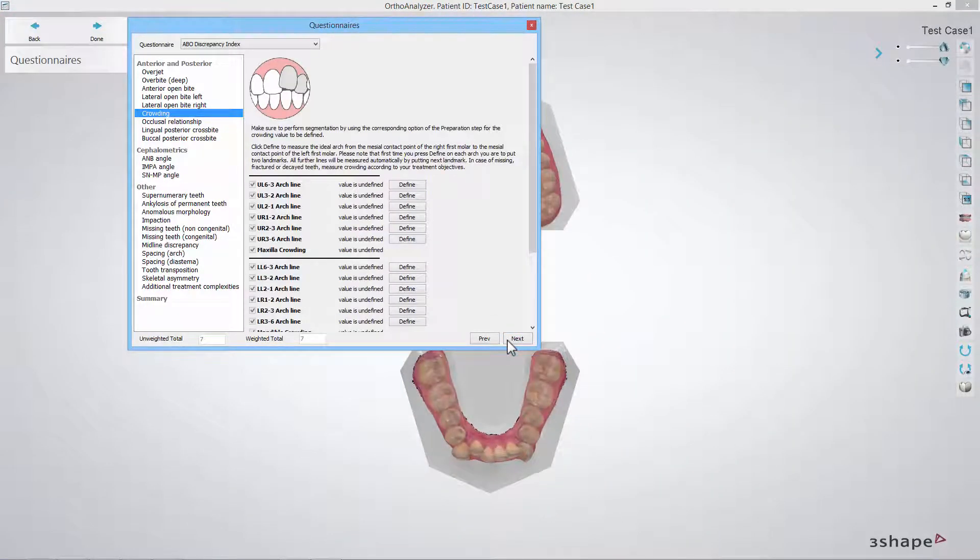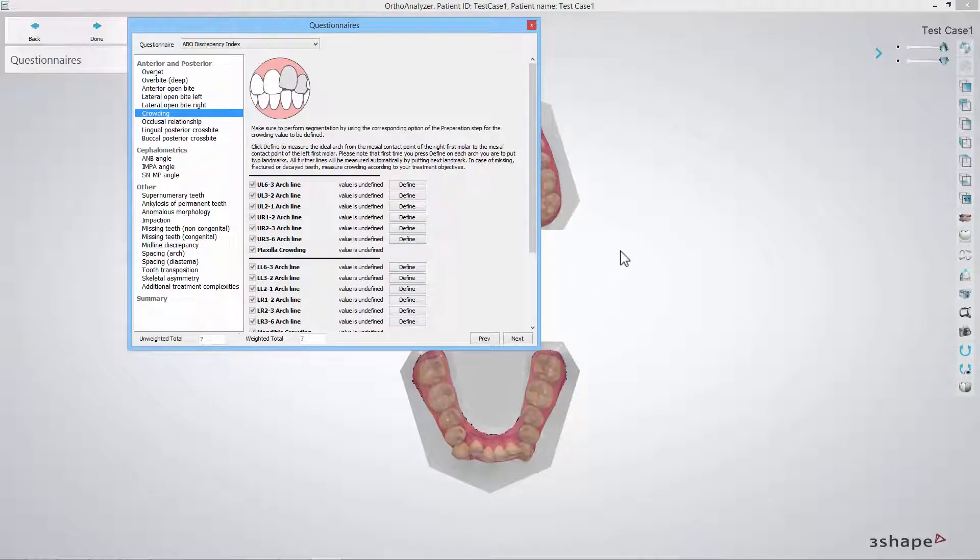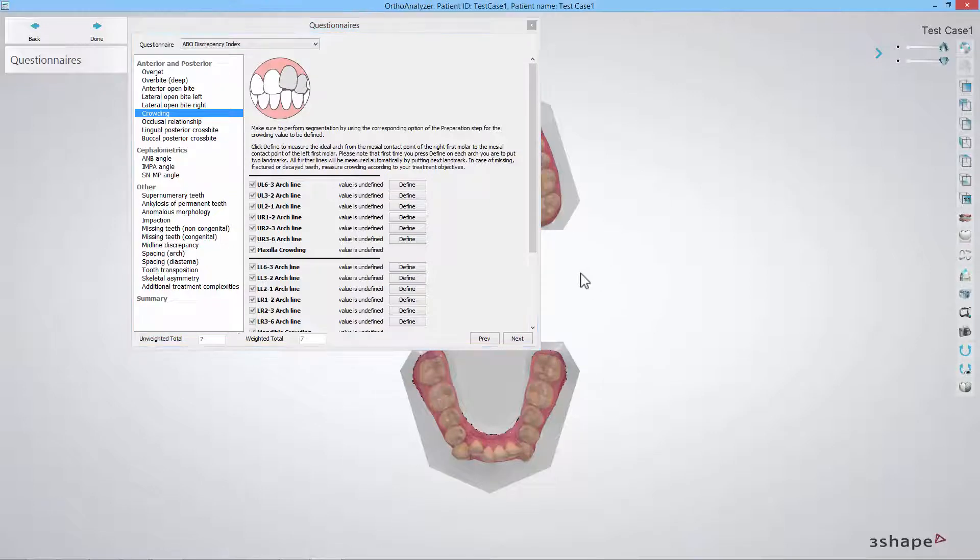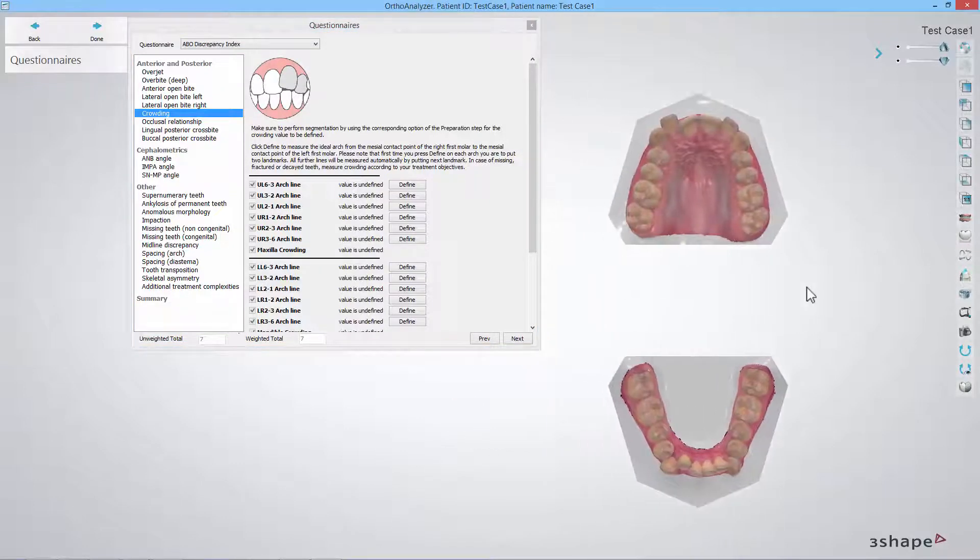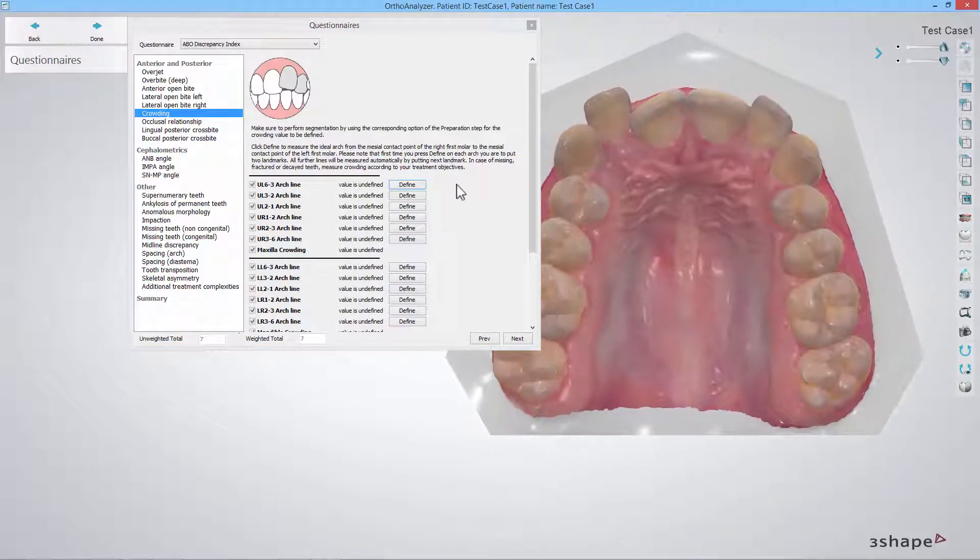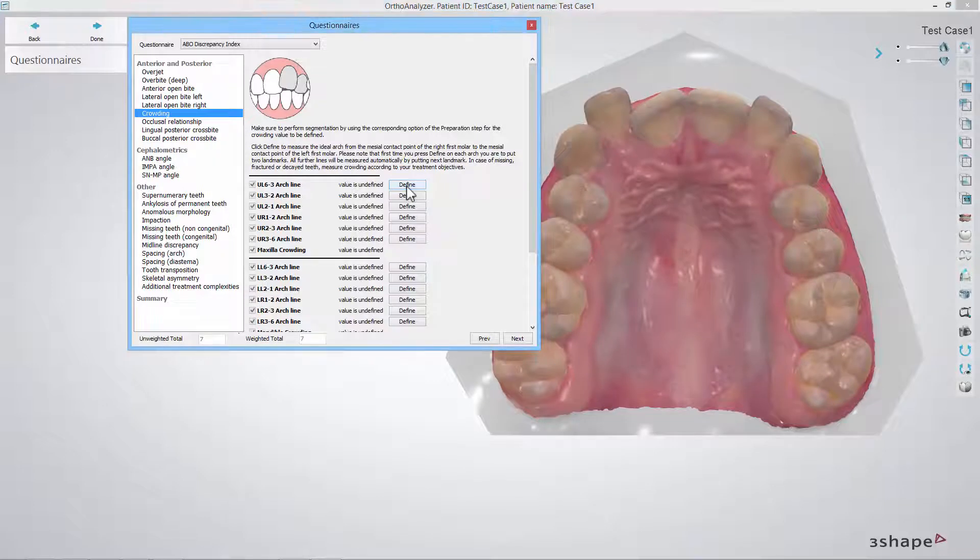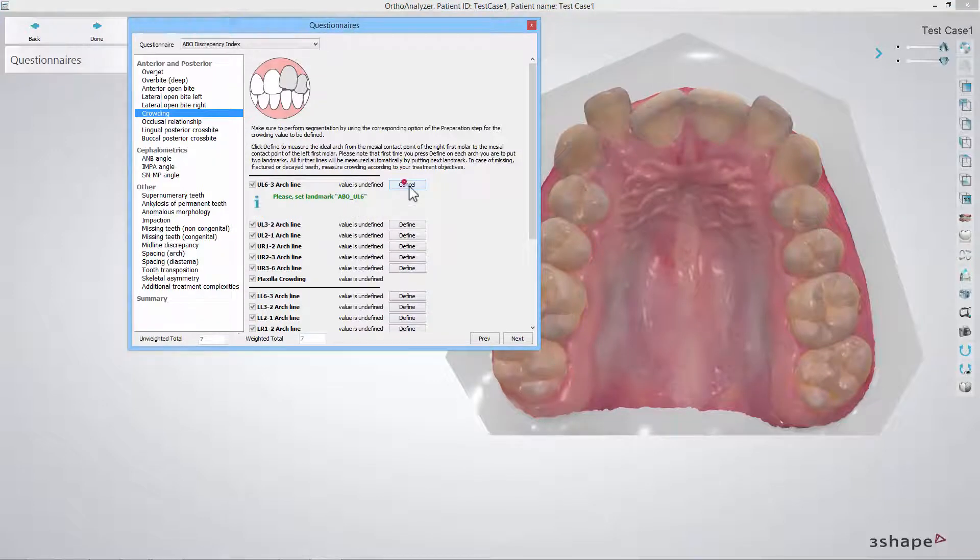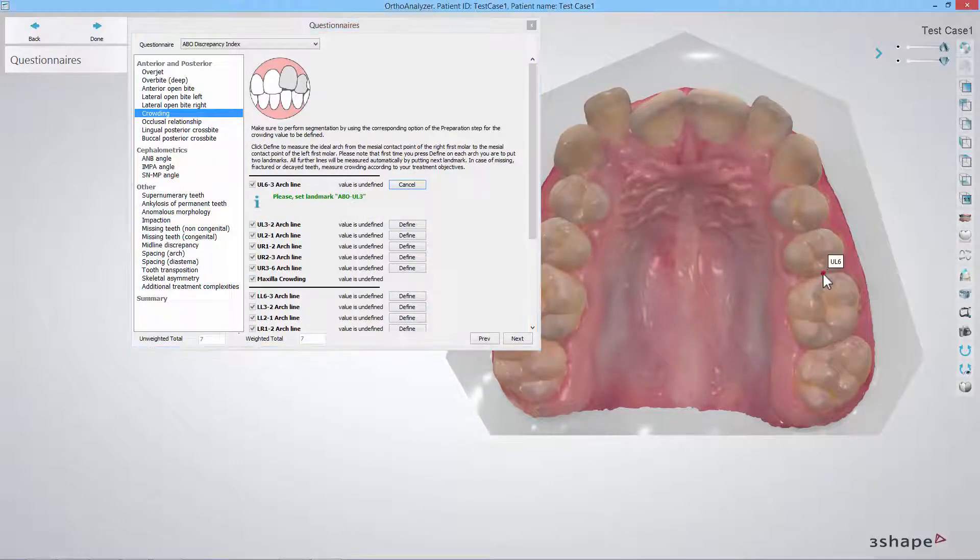In the crowding step you should define an ideal arch for both the maxilla and the mandible from the mesial contact point on the left first molar to the mesial contact point of the right first molar. Click the define button and start with placing two landmarks to start setting up the ideal arch.